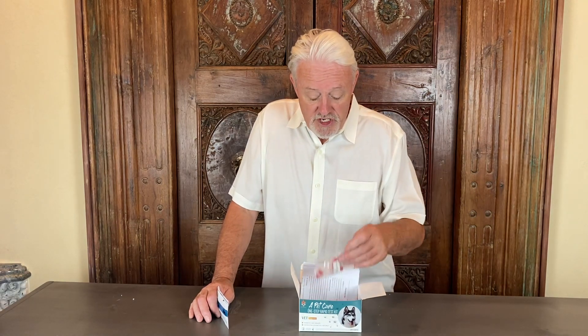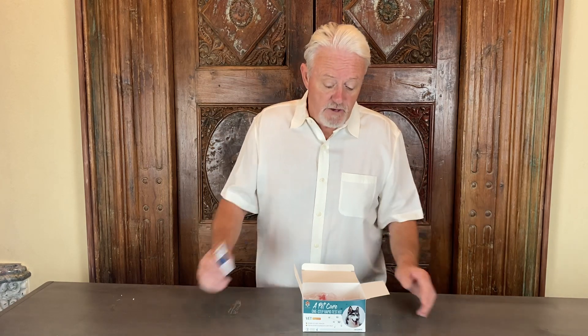The last one is the Giardia test, which addresses a gut problem that's fairly common in puppies. Rather than having to go to the vet and wait for a flotation test, you can within minutes know whether or not you have a puppy with Giardia, so you can treat it with the appropriate medication, which is metronidazole.